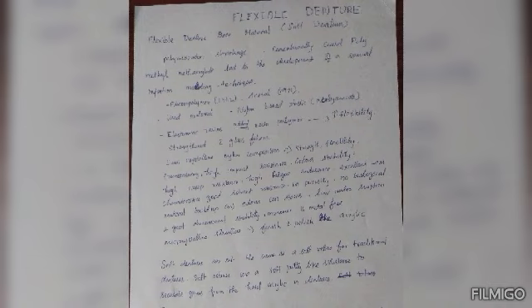The first used material was fluoropolymer in 1962 and acetal in 1971. The material used here is nylon based plastic, polyamide. Elastomeric resins are added to the resin polymer, so it gives higher flexibility, and glass fibers are added to this, so it gives strength to the flexible denture.